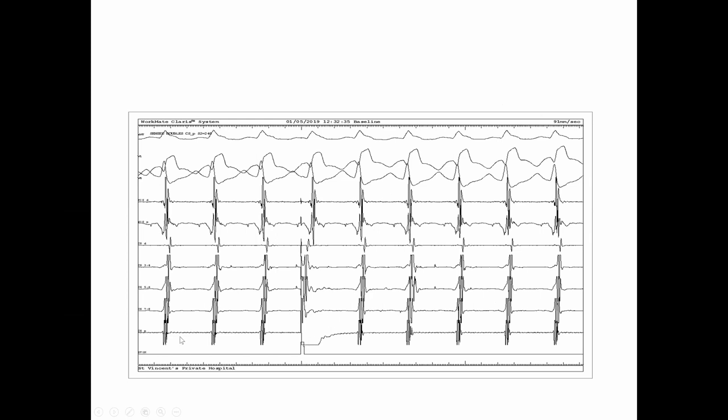So tachycardia is going long. You can very clearly see the pacing stimulus with pace CS prox. You can see this next atrial activation is clearly being brought in. The question is, has it affected the tachycardia at all? And so measuring two A to A intervals beforehand and around this beat, it has completely not affected the tachycardia at all.